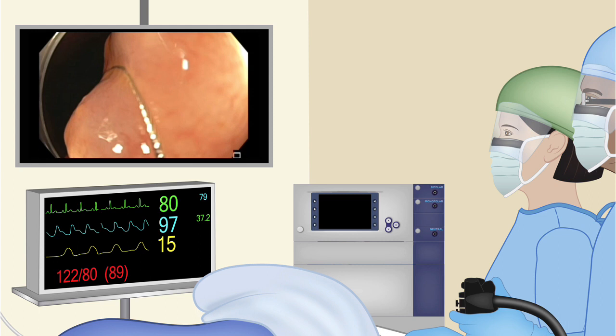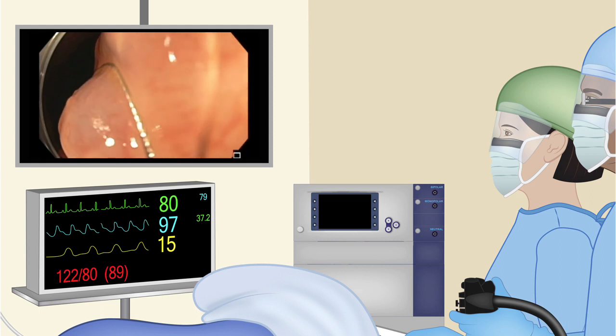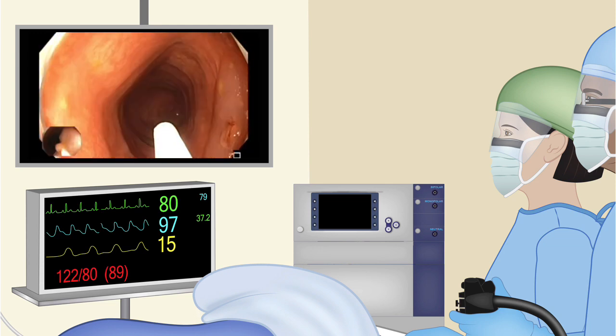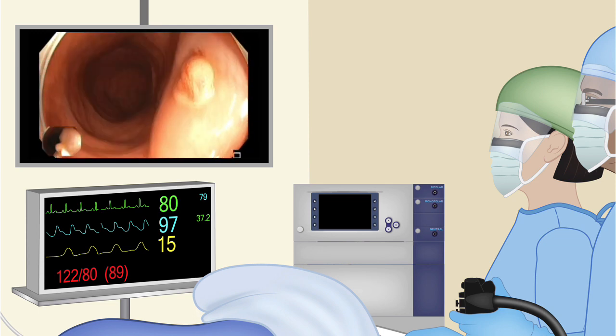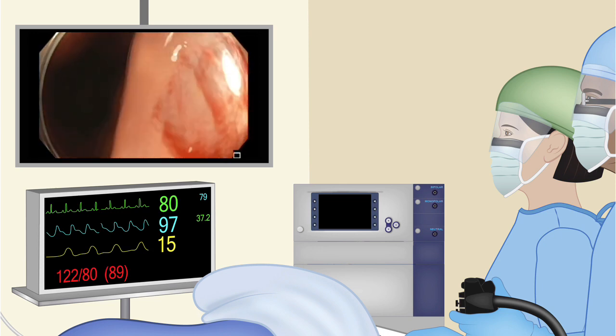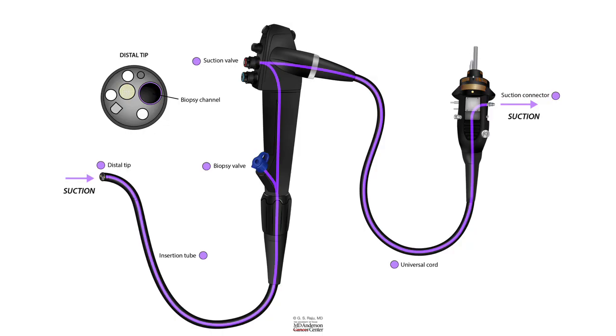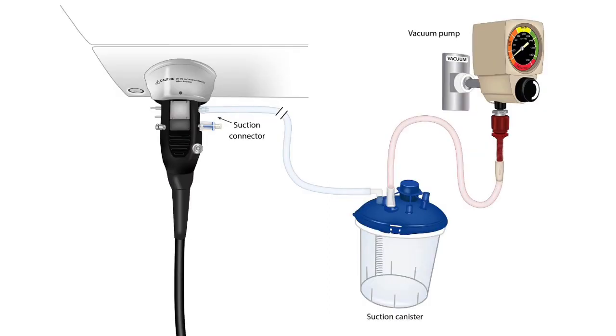So here is a case where the endoscopist has resected a polyp using cold snare resection, and the polyp has been suctioned into the biopsy channel. So what happens with the suction? When you apply suction, it goes to the suction outlet, and if you did not put the trap, it will go into the suction container.